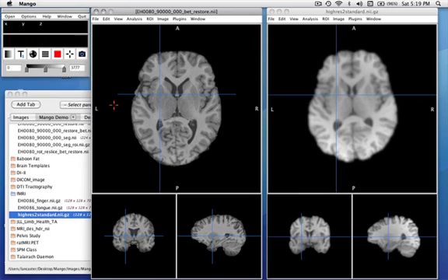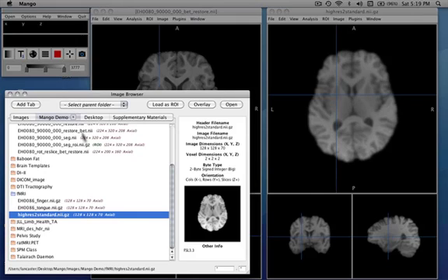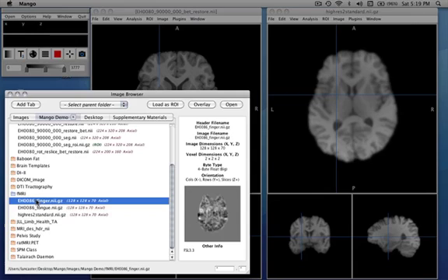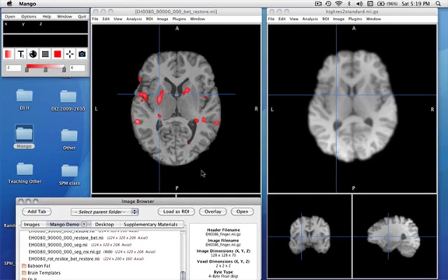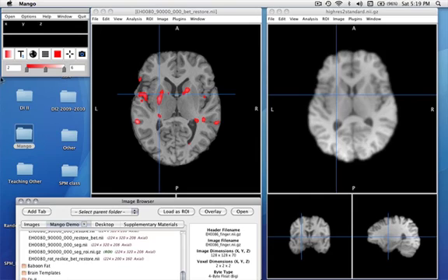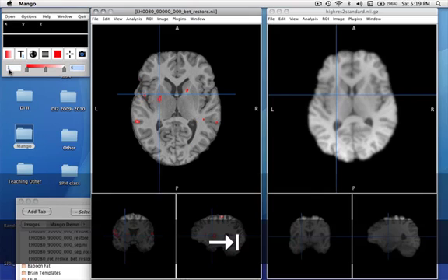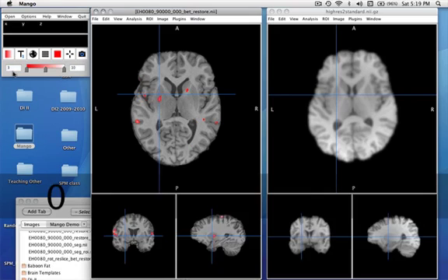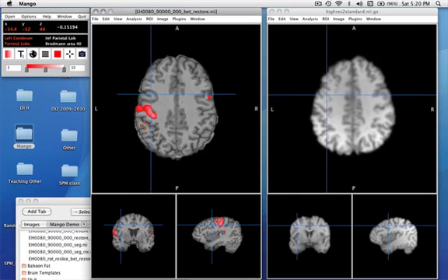There's another nice feature working in this space. If we come down here, these are some functional MRI results. I'm going to load this finger tapping result as an overlay. It actually came from the study of the image on the right, but we're able to overlay it onto a different person's high resolution image, and I'm going to adjust the display a bit so these things look a little more reasonable. And move it a little higher up.